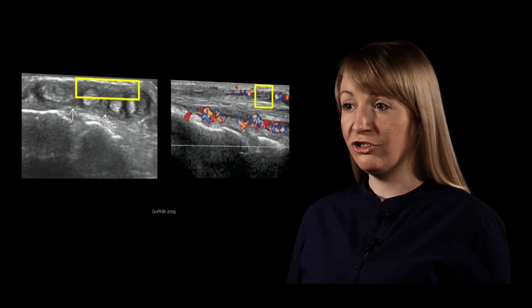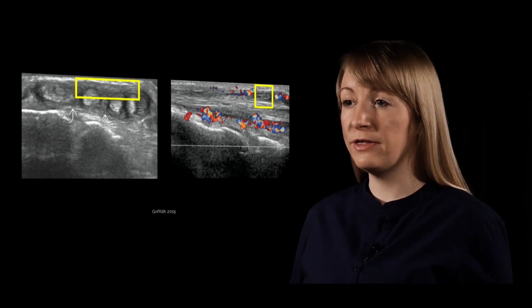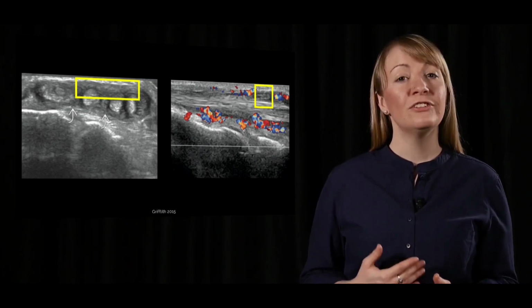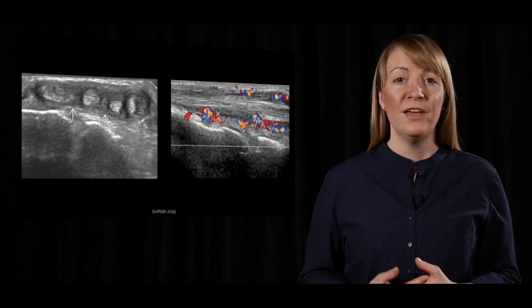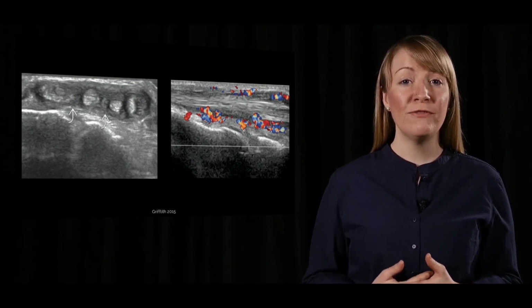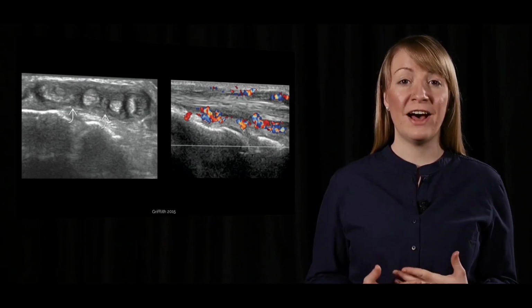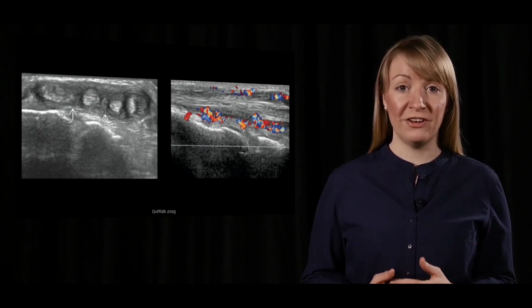The shape of the tendon sheath has changed. It shows moderately severe synovial thickening with no visible tendon sheath effusion, suggestive of chronic tenosynovitis. The extensor tendon shows synovial thickening extending along the dorsum of the hand with severe hyperemia, consistent with active chronic tenosynovitis.